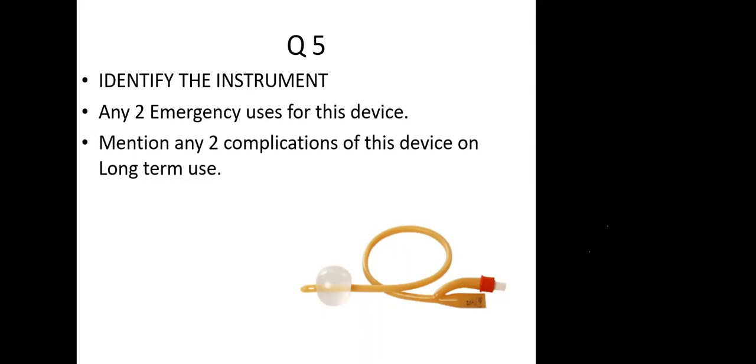Beyond this, please remember, in the urology, some people will still do a nephrostomy if they're operating on a hydronephrosis, and if they feel the creatinine, the GFR is pretty low. So there was an old school of doing an open nephrostomy. Now, can you mention any GI uses of a Foley's catheter?